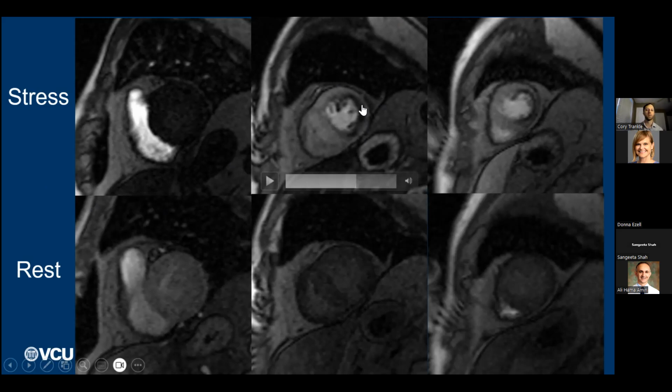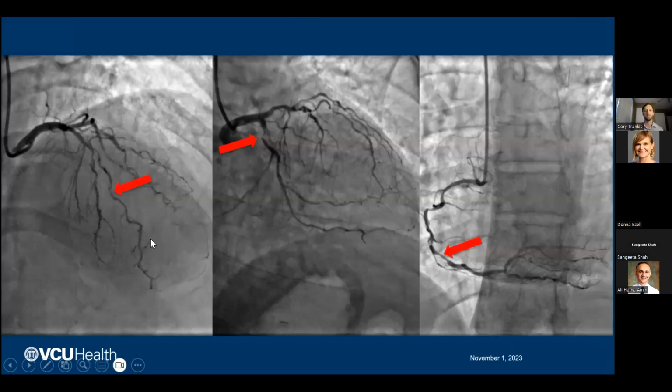There's a point where it starts to slowly brighten up before it reaches the epicardial surface. And it's also in a coronary territory, right? This would fit pretty well with the circumflex territory, or maybe a dominant right. So everything lines up for this being a real perfusion defect, and these are the things we look for. And sure enough, this patient turned out to have multivessel disease.